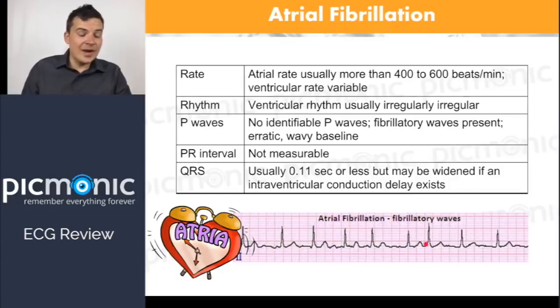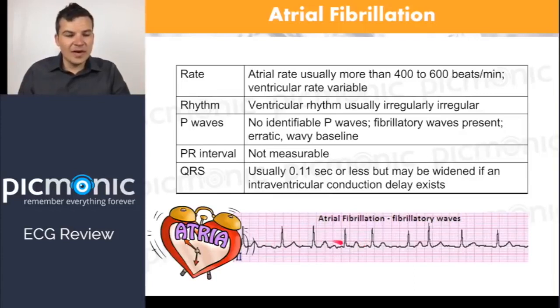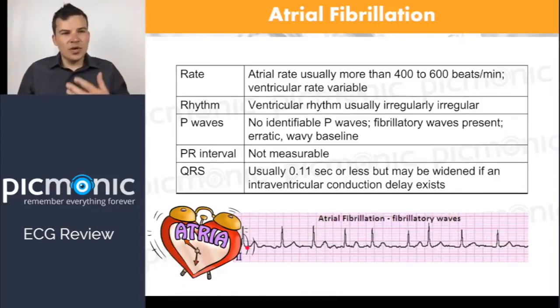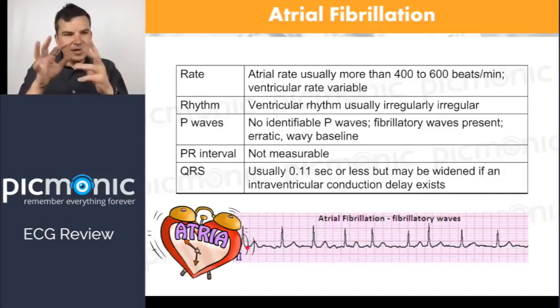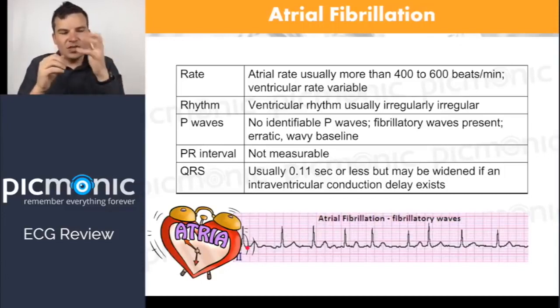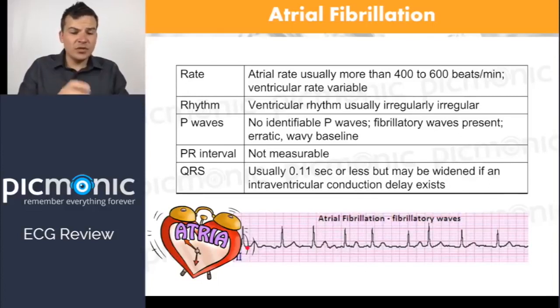And if you tried to go ahead and find the P to P, you can't. You can't find the P to P because where are the P waves? Well, here's where you have the difference between what we would call junction rhythm and fibrillation. Fibrillatory waves are just, imagine quivering, right? Quivering, quivering, fire, quivering, quivering, quivering, fire, quivering, fire. It's really just like being electrocuted, I guess, or tased at a random interval because you're freaking out and then you just fire. But there's no pattern to it whatsoever. And that's exactly what fibrillatory waves are.